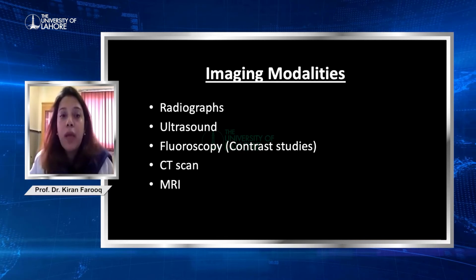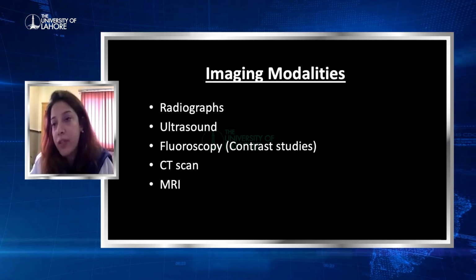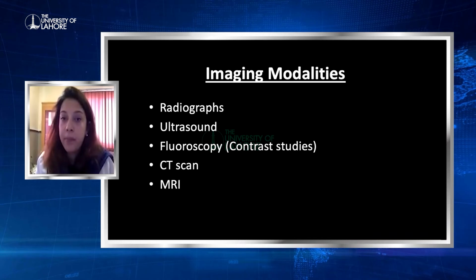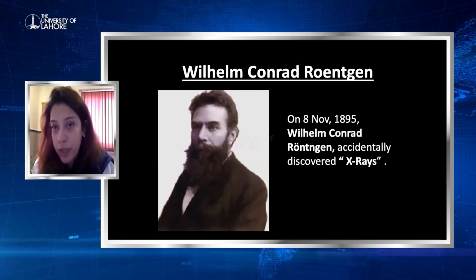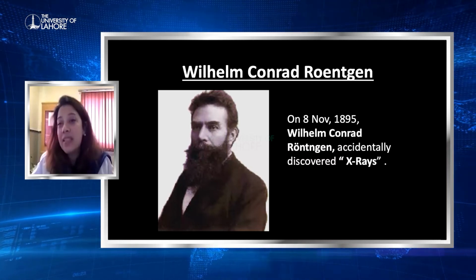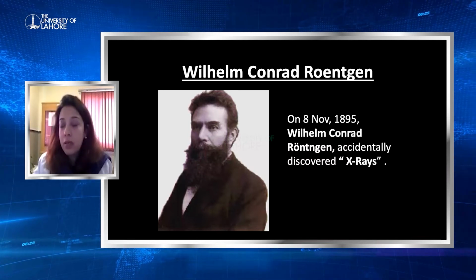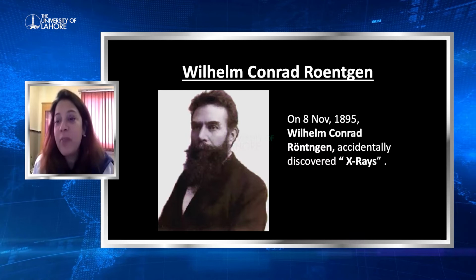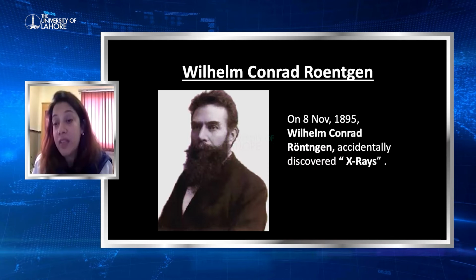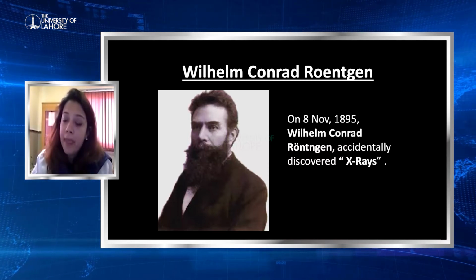Now coming to the imaging modalities. These are more or less the modalities that every hospital uses, ranging from X-rays, then ultrasound, fluoroscopy, CT scan, and MRI. I think everybody among our radiology colleagues knows who this gentleman is. His name is Wilhelm Conrad Röntgen, and he accidentally discovered the X-rays way back in 1895. He was experimenting with radiation, and suddenly he saw how an image was formed. That is why X-rays are still called X-rays, although we now know they are electromagnetic waves.